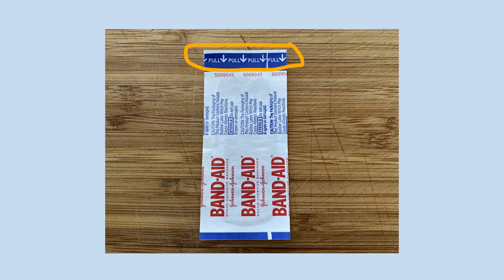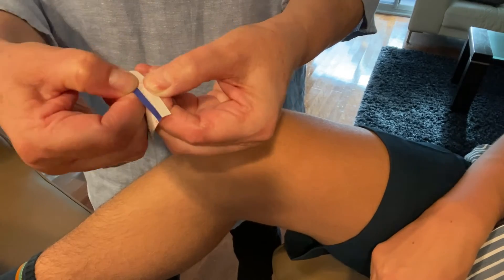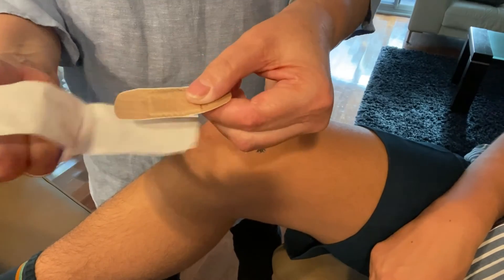To open the band-aid, find the top part of the band-aid that says 'pull' and has an arrow. This is the part you need to hold with your two thumbs and pull your thumbs away from each other.